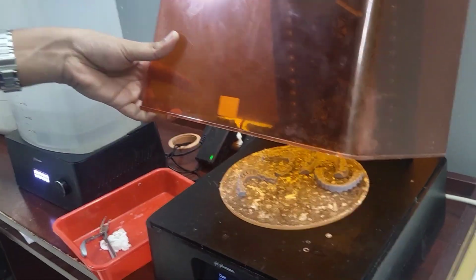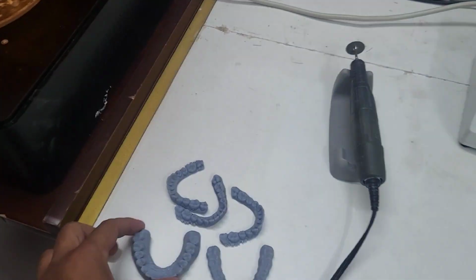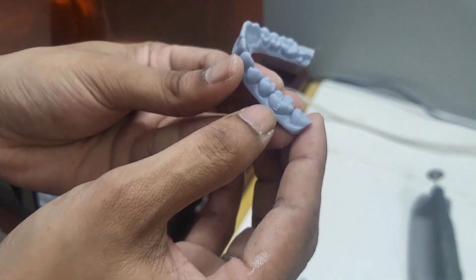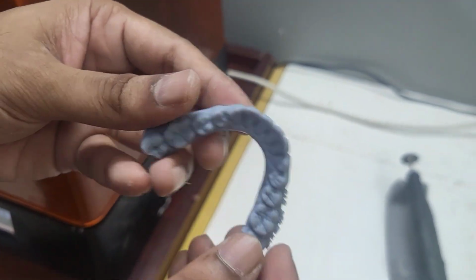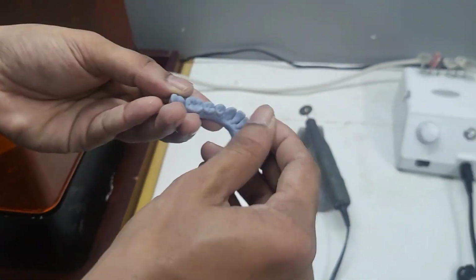has been completed. We are retrieving all the models, and this procedure will cure the residual resin that was superficial and make the cast more distinct, more prominent. You can see the cast has more distinct and prominent features.